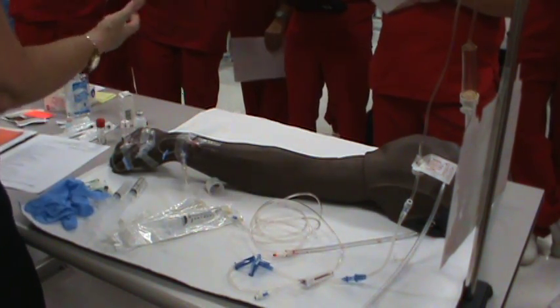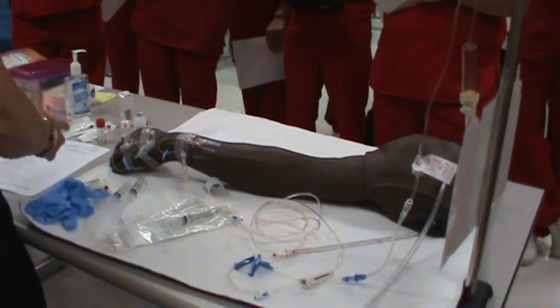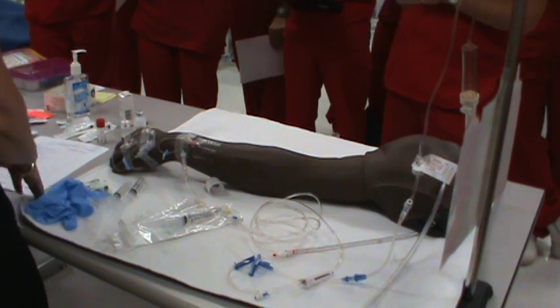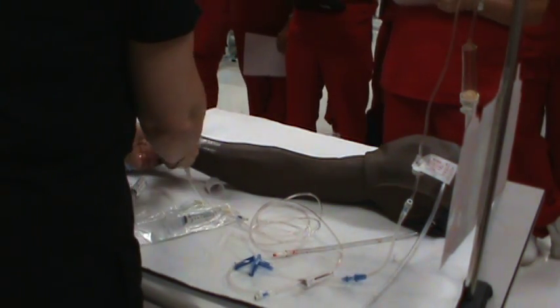So definitely push your mL. Wait a minute. Push another and then do it that way. Okay. All right.